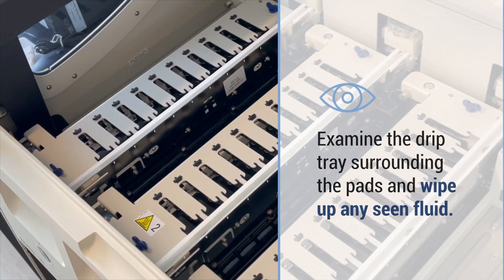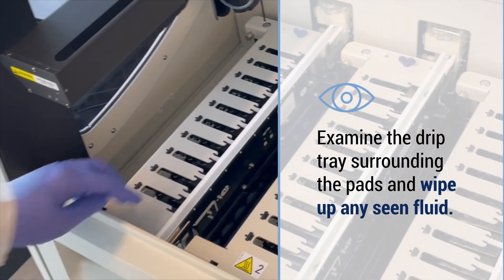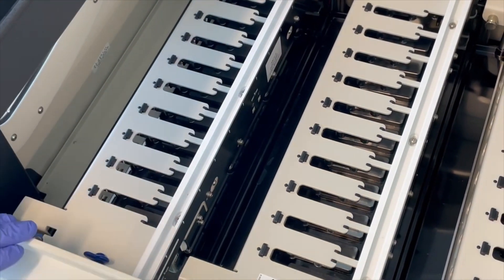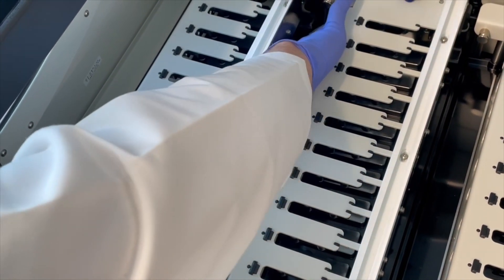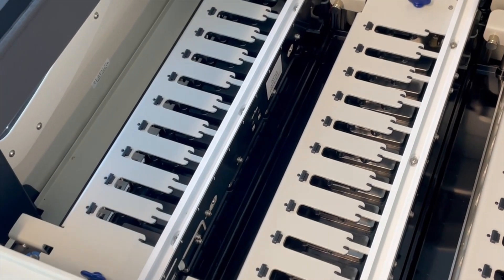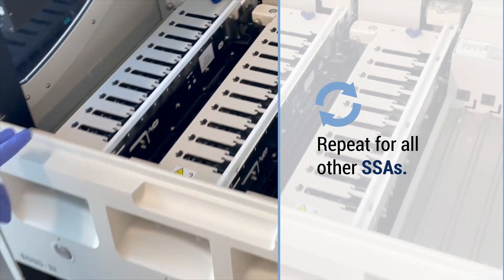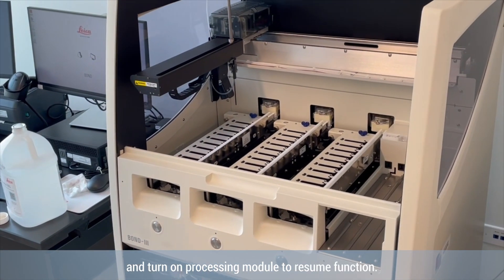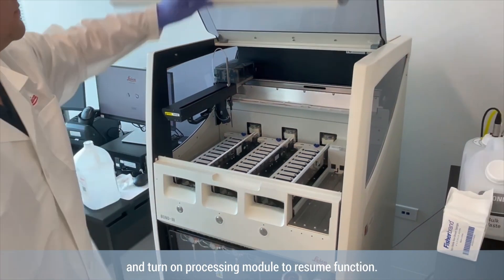Examine the drip tray surrounding the pads and wipe up any visible fluid. Repeat these steps for all other SSAs. Close the lid and turn on the processing module to resume function.